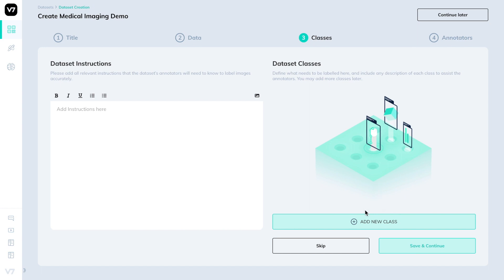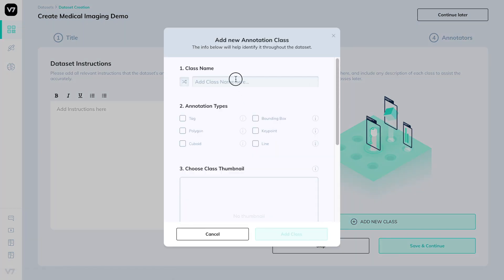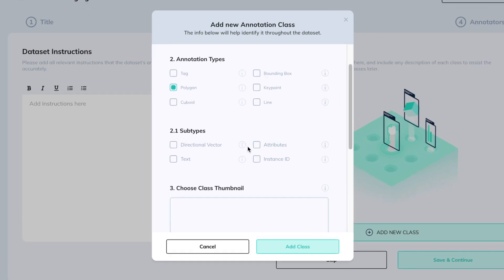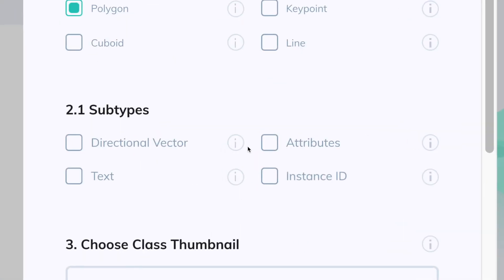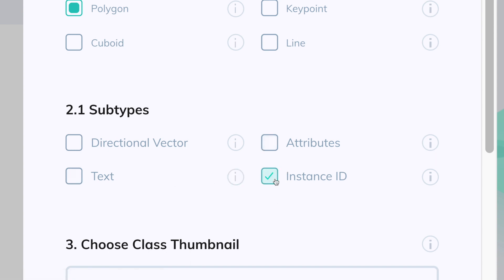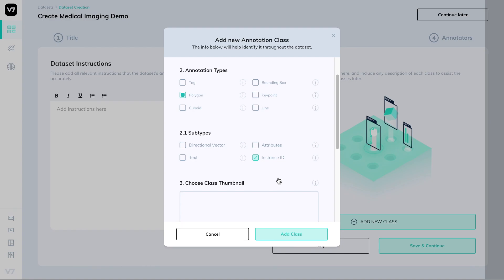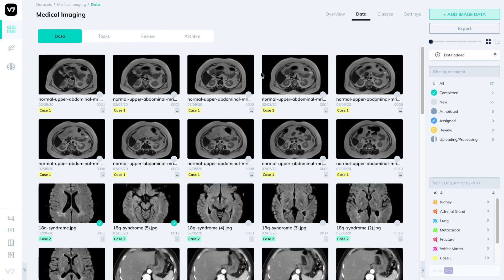When our data is uploaded, let's create some classes. I'll create a heart class, give it a polygon mask annotation type, and then we can give it some subtypes. These can be directional vectors to show their pointing, attributes to add more detail, instance IDs, or text. We'll be adding instance IDs since this is a 3D segmentation project.